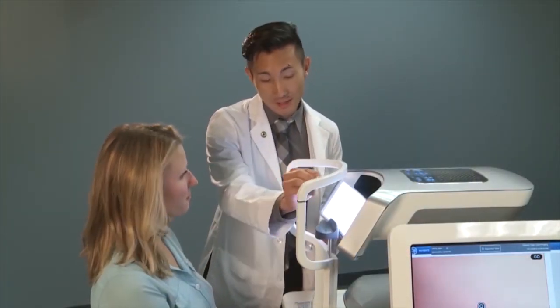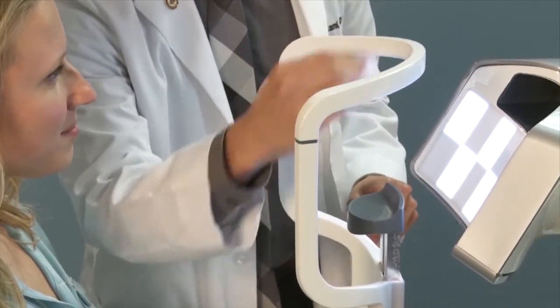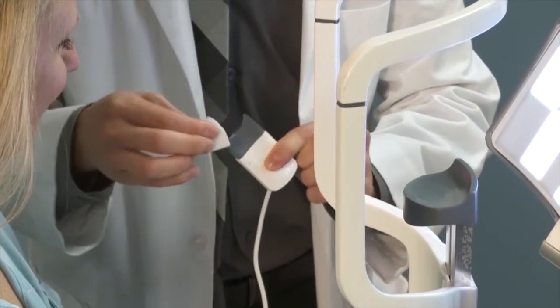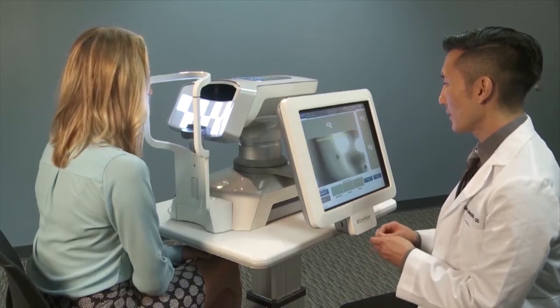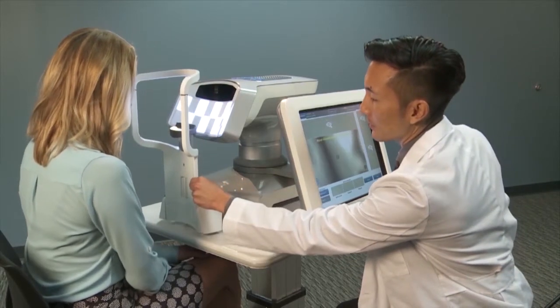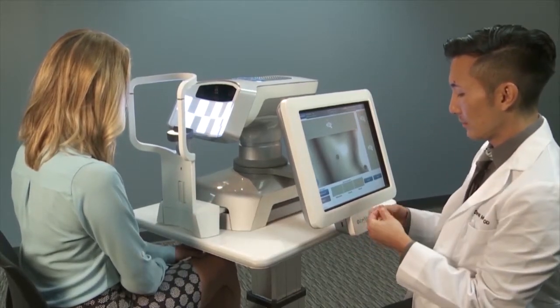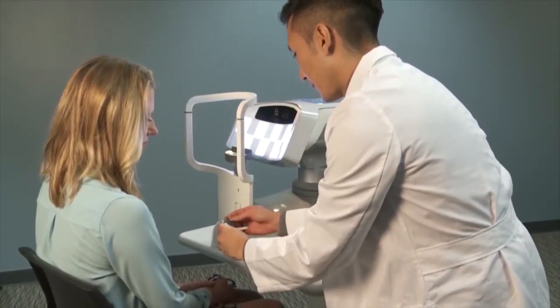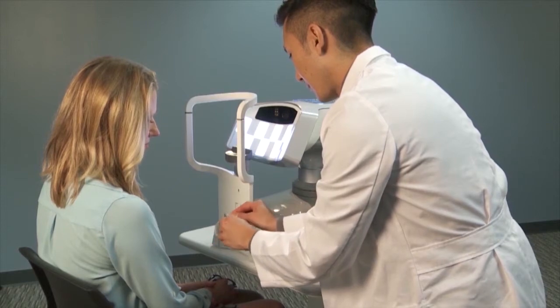Disinfect the chin and forehead rest and the handheld near-IR lid everter with 70 to 90% concentration isopropyl alcohol prior to use. Turn the room lights down or off and make sure the chin rest is in the correct position, extended away from the device and closer to the patient. Inspect the lid everter to ensure the edges are smooth and intact before using to evert the patient's eyelids.